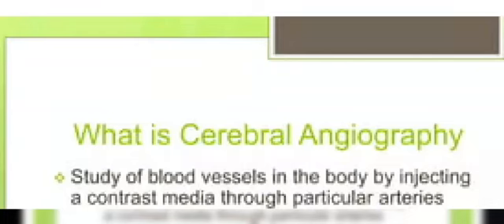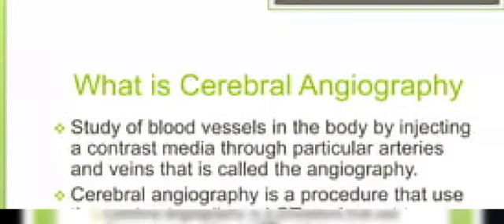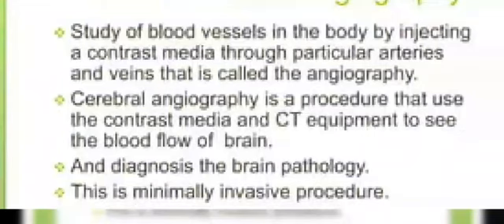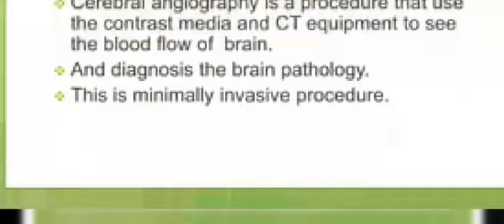In cerebral angiography, we study the blood vessels in the body by injecting the contrast media through particular arteries and veins. So that is called angiography. That is, cerebral angiography is a procedure that uses contrast media and CT equipment to see the blood flow of the brain, and helps us to diagnose the brain's pathology. And this is a minimally invasive procedure.